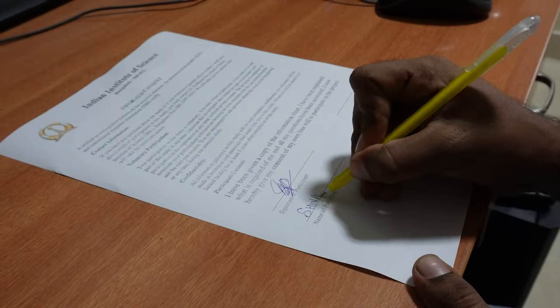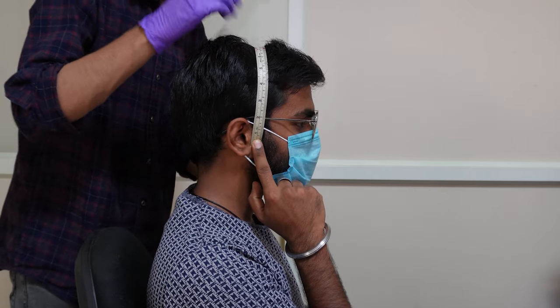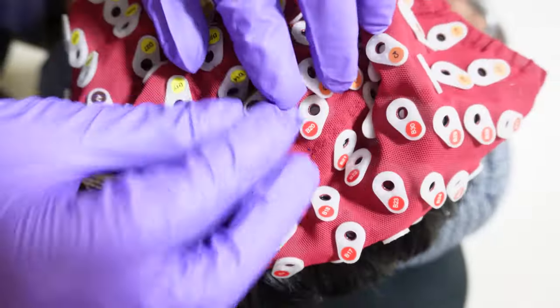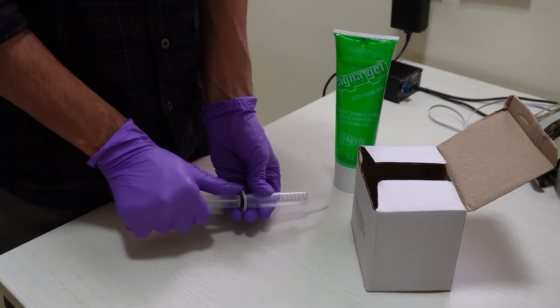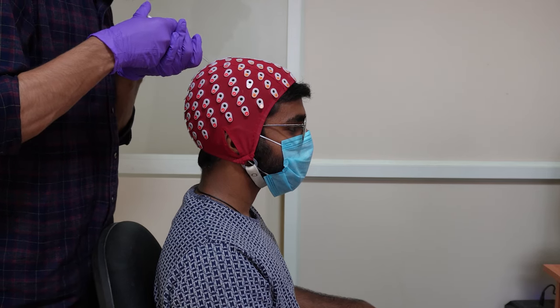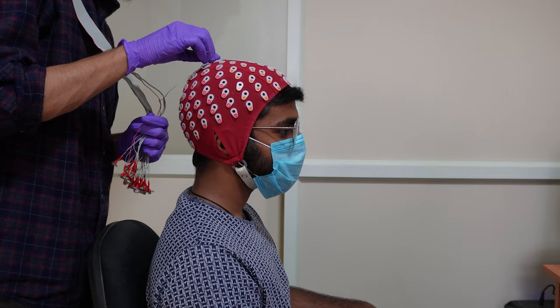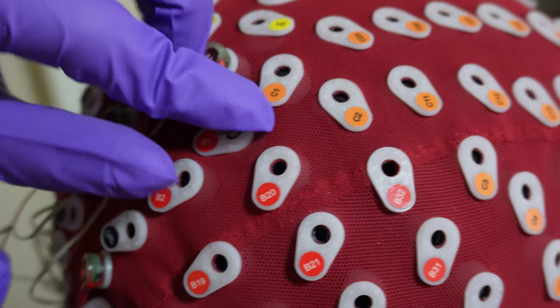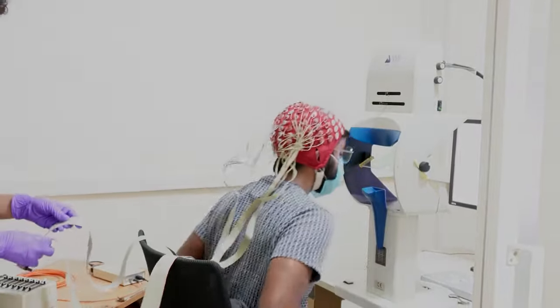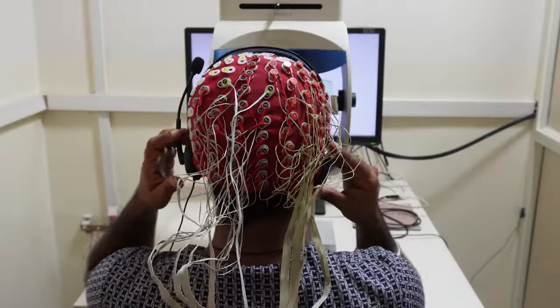We start with the volunteer coming in and filling out an informed consent form, indicating their willingness to participate in the experiment. We then take measurements of their head to select a properly fitting EEG cap. Once they are comfortably wearing the cap, we inject conducting gel in the holes of the cap with a syringe. This gel allows electrical activity from the scalp to flow to the EEG electrodes. Over 100 electrodes are fitted into the cap, one in each holder. The participant is then seated in the experiment room with their head resting on the chin rest facing an LED monitor. The experiment is now ready to begin.